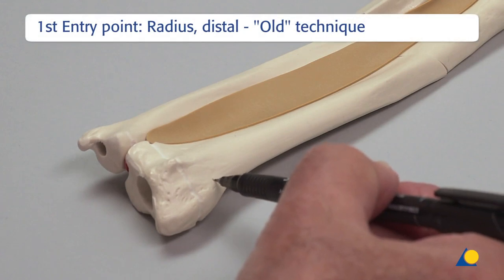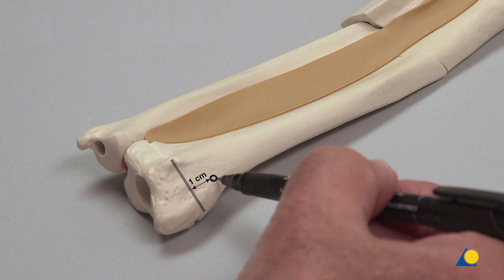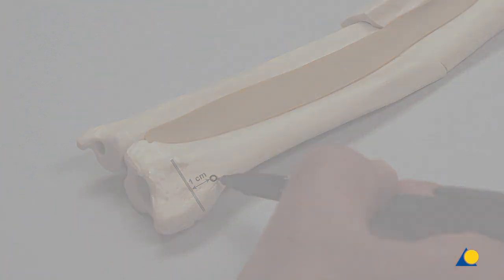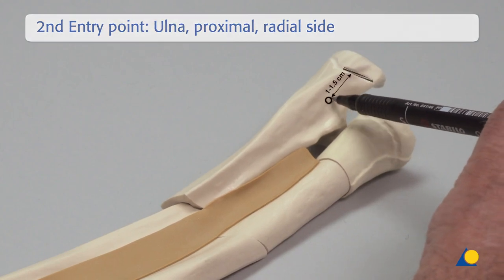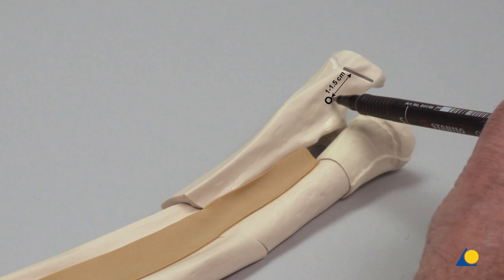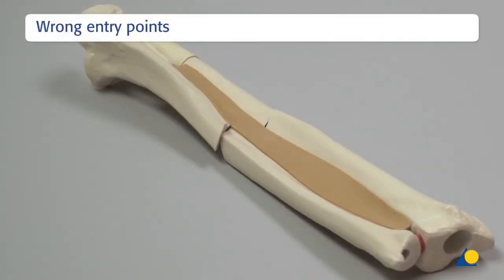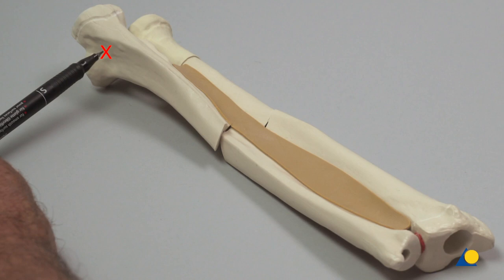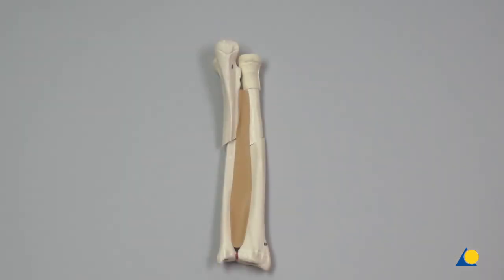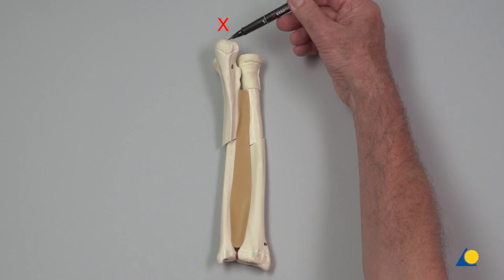The nail entry point for the retrograde technique on the radius is on a 45-degree plane between the dorsal-volar and radial-ulnar plane, 1 cm proximal to the growth plate. The nail entry point for the anterograde technique on the ulnar is on the radial side of the proximal metaphysis, 1 to 1.5 cm distal to the apophysial plate. Be aware that an entry point on the ulnar side of the proximal ulnar can cause severe injury to the ulnar nerve. A direct straight insertion through the olecranon must be avoided as this results in insufficient stability.